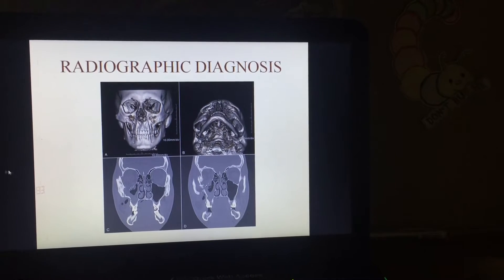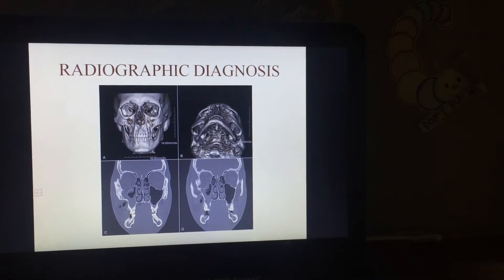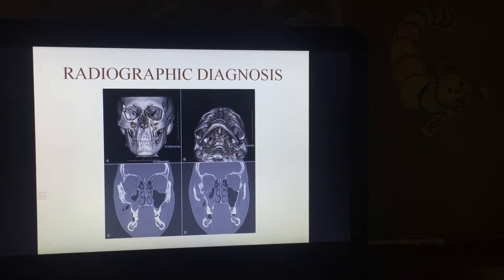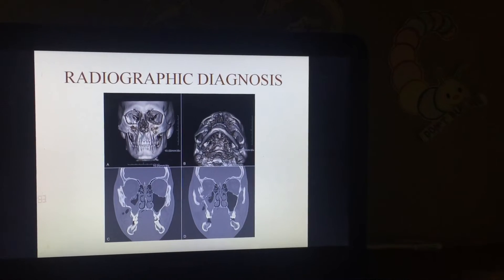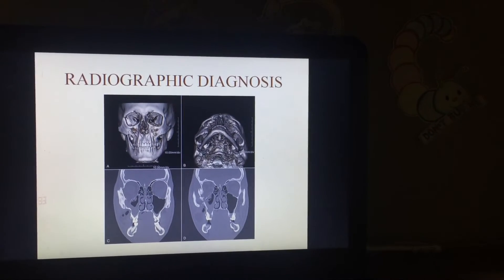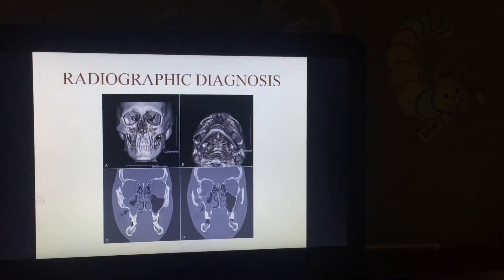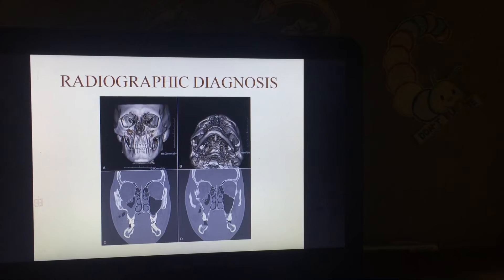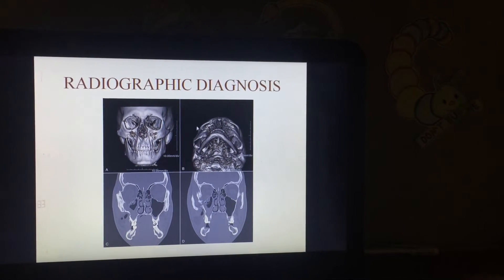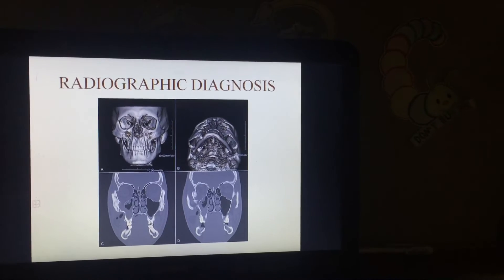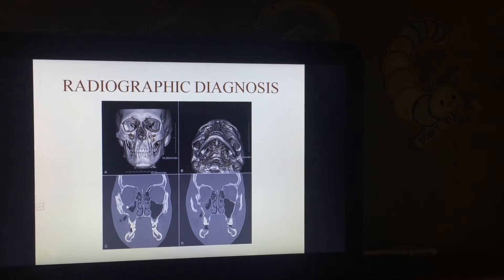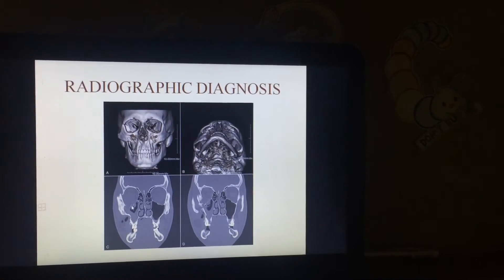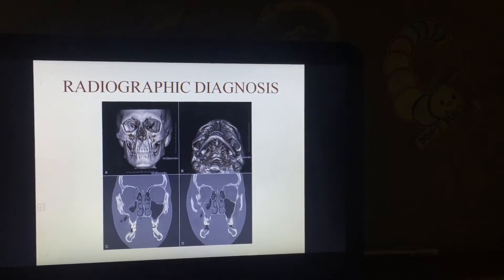On this CT scan, we can clearly see that there is no fracture on the normal side, but there is a discontinuity of the bone at the frontozygomatic suture, as well as discontinuity in the infraorbital region, which is indicative of a zygomatic bone fracture. From this view, there is some displacement — the bone in this area is depressed compared to the other side. Part of the sinuses is occluded with blood, shown as haziness.